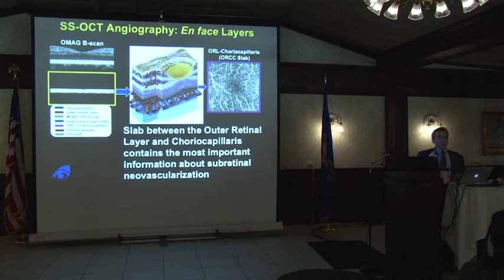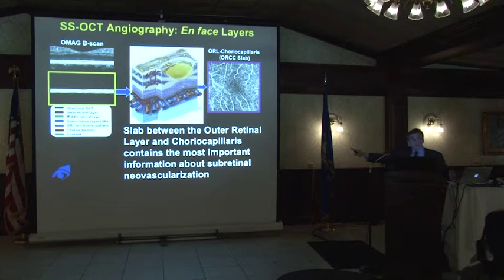What you're seeing is the light passing through the retinal vessels and reflecting off of the retinal pigment epithelium. So you get a motion artifact where those retinal vessels are projected onto a screen, much like light is projected here onto a screen, okay? And those are artifacts. Sometimes they're useful. Most of the time, they're a nuisance. But I'm going to show you the techniques that we can use now to get rid of those artifacts.